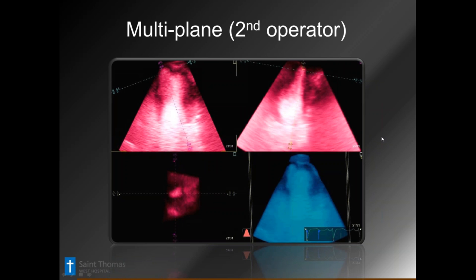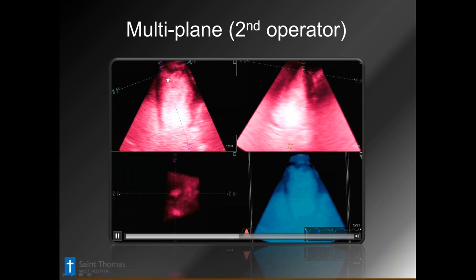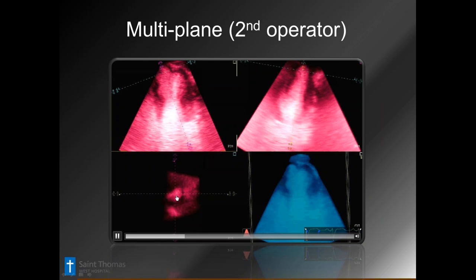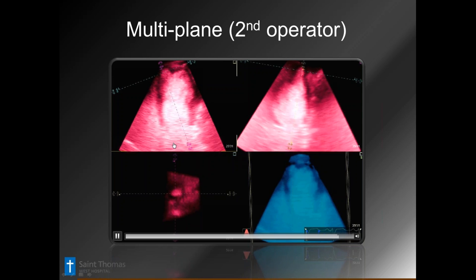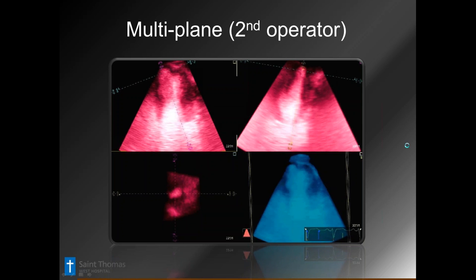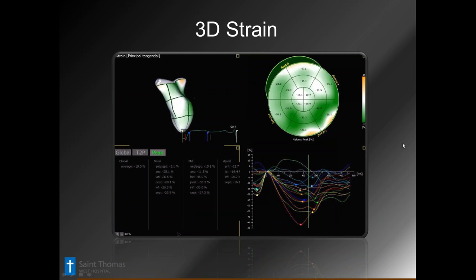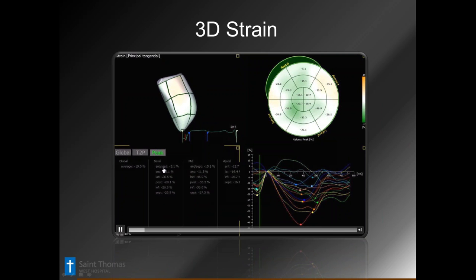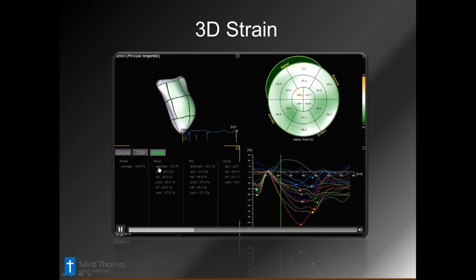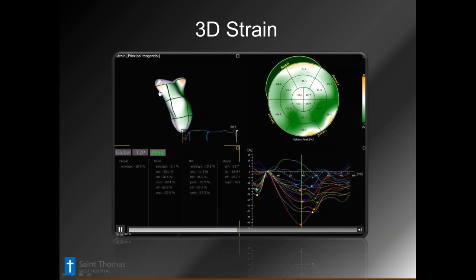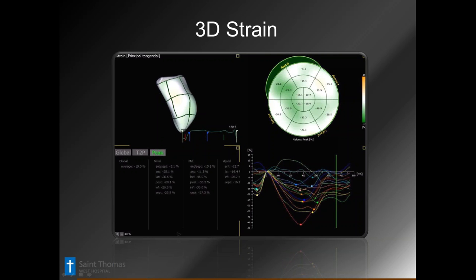I'm very excited about using contrast in high frame rate 3D volumes — getting good data. Here's a visual image where I've rendered it at the apex, looking at this little aneurysm that kind of pooches out in systole and gets larger — a smoothing color algorithm, but you can get really good wall motion images. The 3D strain map is showing very little motion in the entire septal part of the base, down where the aortic valve is. You can also very clearly see the bundle branch block on strain tracking — you'll never miss that after this.